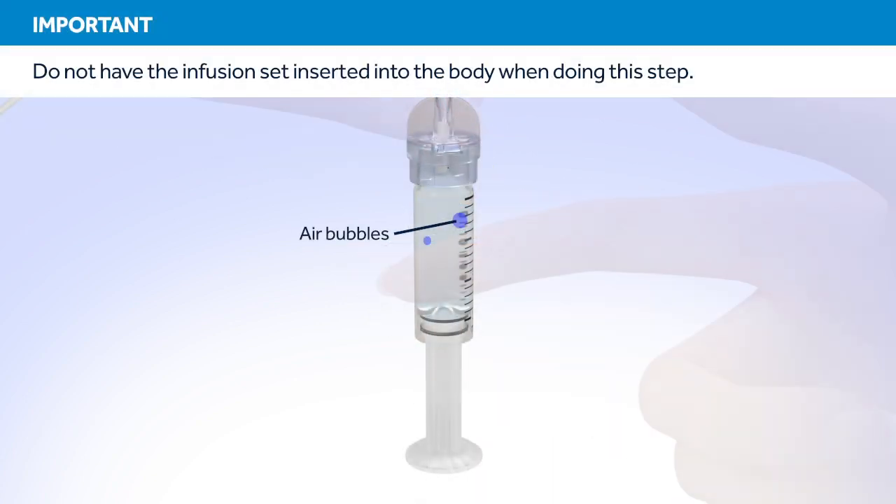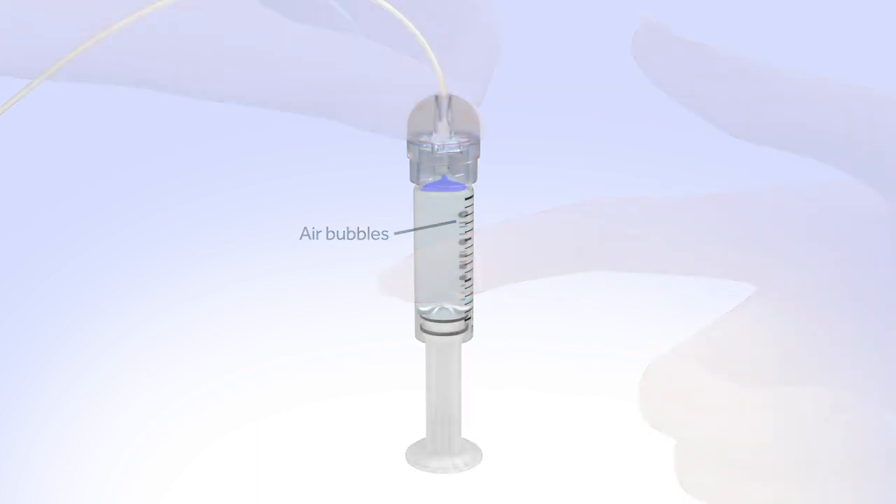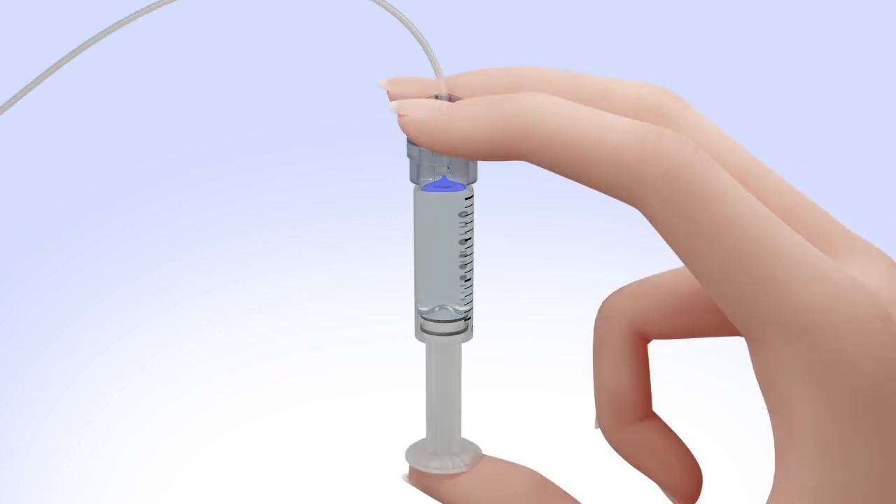Tap the reservoir to make any air bubbles rise to the top of the reservoir. Purge the air bubbles that have risen to the top by slowly pushing up on the plunger until all of the air bubbles have been pushed out of the reservoir and you see a small amount of insulin in the tubing. If you're not able to push insulin into the tubing, disconnect the tubing connector and then reconnect it.